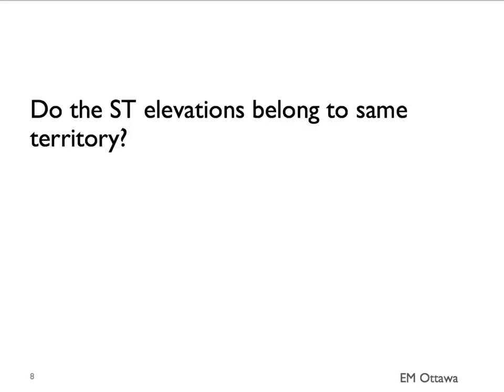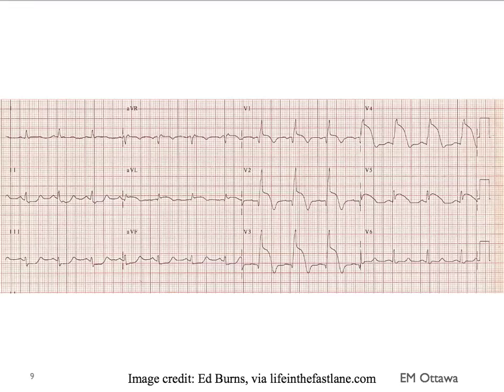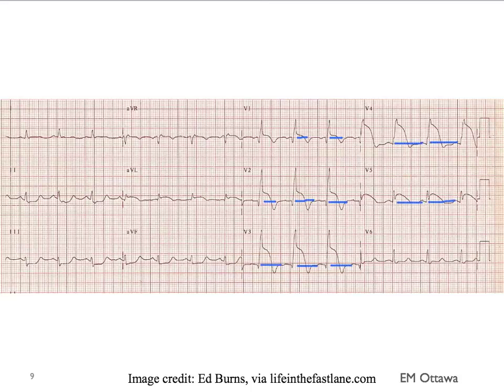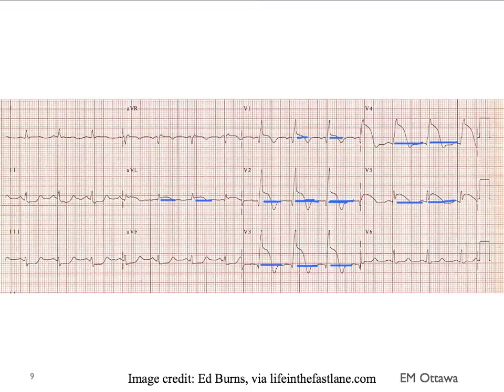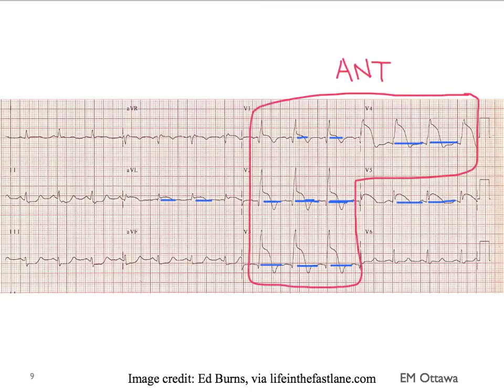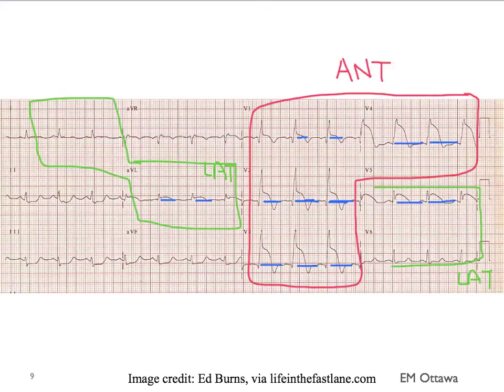If we see ST elevations on the 12-lead ECG, we want to ask: do these elevations belong to the same territory of the heart? Looking at an example — ST elevations are visible in V1 through V5, and there is a very subtle ST elevation in AVL. These belong to the anterior territory and two of the leads in the lateral territory. Therefore, this is an acute anterolateral myocardial infarction.